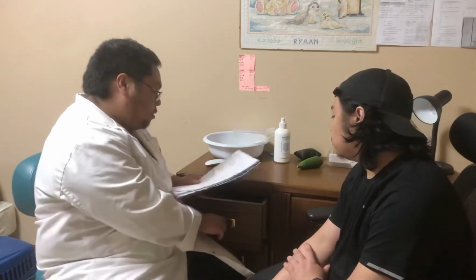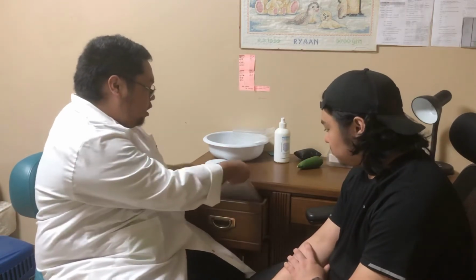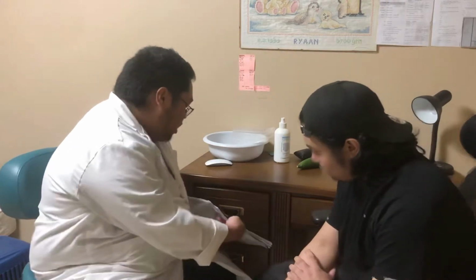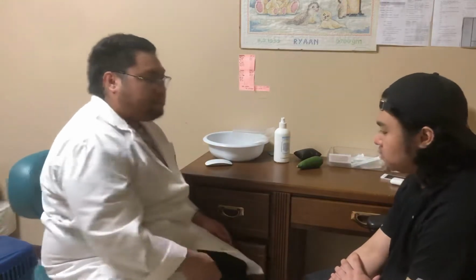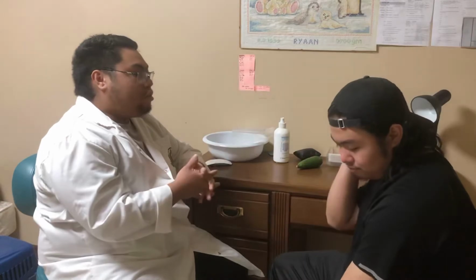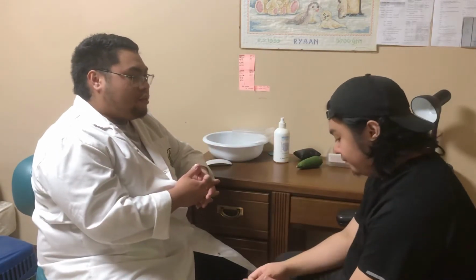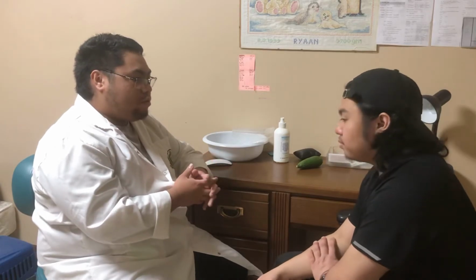So, Mr. Sian, I'm your RT physician for today, and we're going to be performing your ABG analysis. Basically, we're just going to puncture the radial artery, and it's not going to be painful, and it's going to be fast. Are you comfortable with that? Yeah. This is in order to analyze if there's anything wrong with your metabolic system and your respiratory system. Is that good with you?